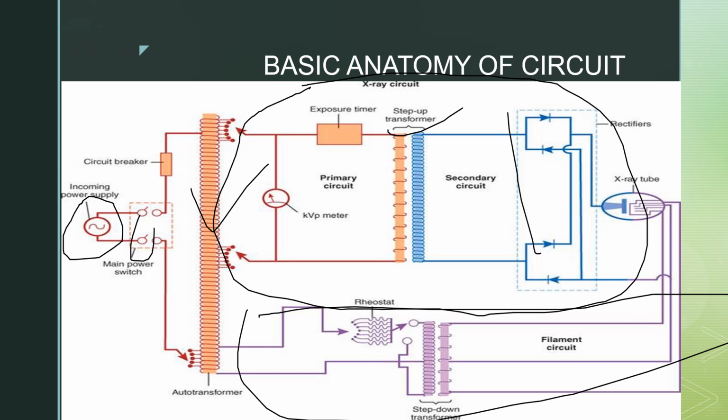And these are the rectifiers, which mainly convert the AC current to DC current, and this is a full wave rectifier, also called a bridge rectifier. So it can convert the two phases of AC current into full wave DC current.